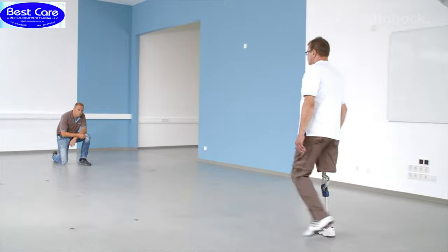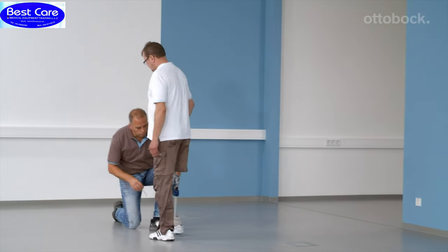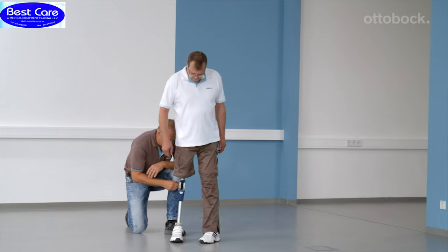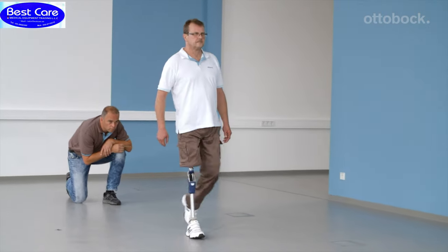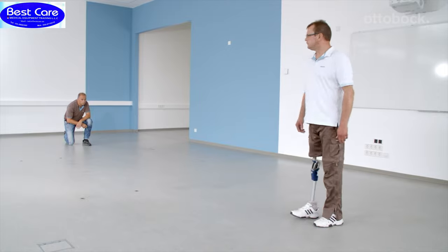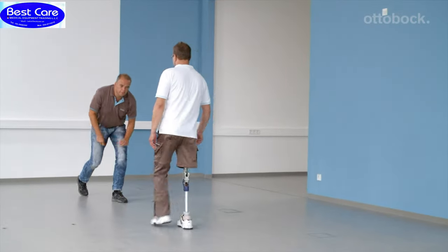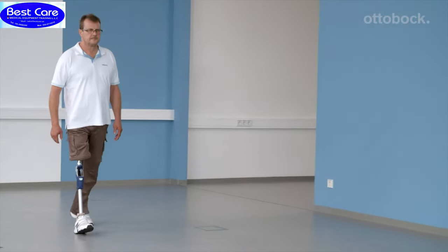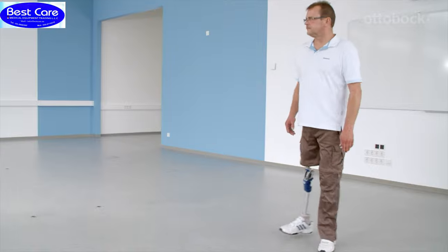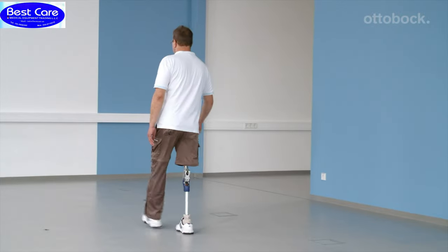At this point, the last check of the dynamic fitting is ensured. Here, the knee axis friction is tightened a little bit so that the extension stop is softer. Now the knee is set optimally for the user, and further walking exercises can be completed.